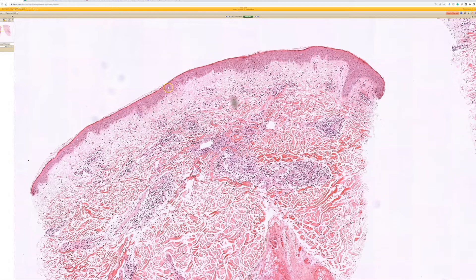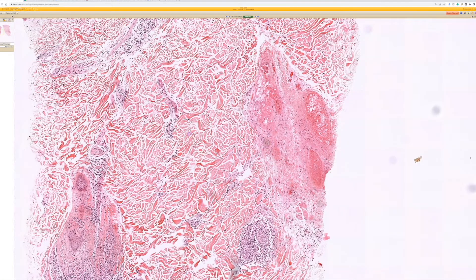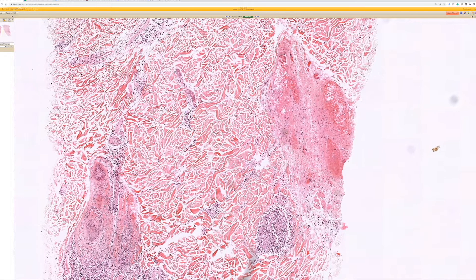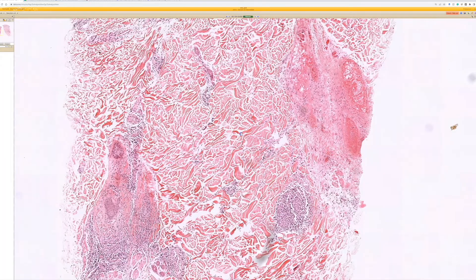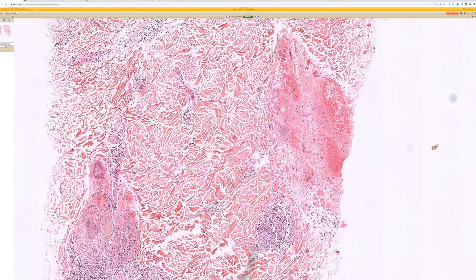I've seen lichenoid infiltrate that on deeper sections ended up being herpes. I've seen necrotic ulcers where if I looked carefully at the edge or cut deeper I found herpes. There are rare reports of leukocytoclastic vasculitis or perivascular infiltrate only that was positive for herpes on PCR. A lot of times now you're doing PCR right off the bat if you have suspicion, but sometimes herpes can have a sneaky presentation and not be suspected.